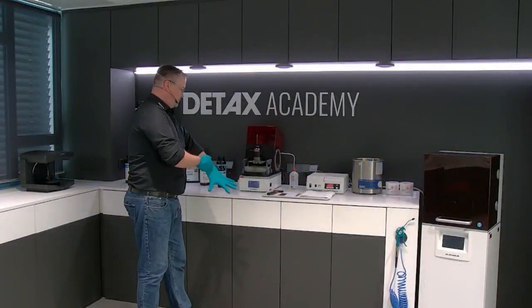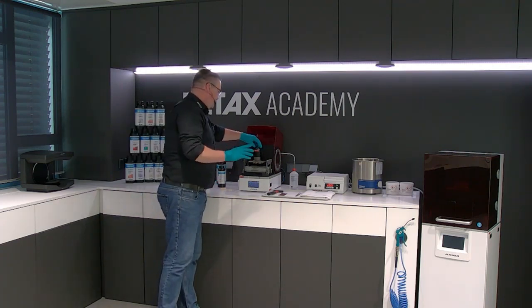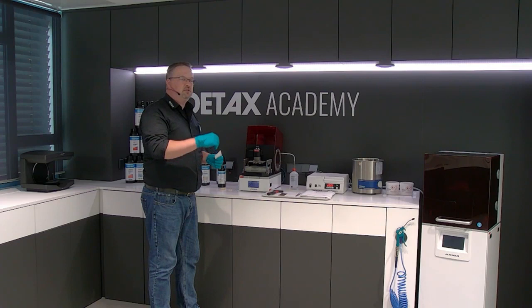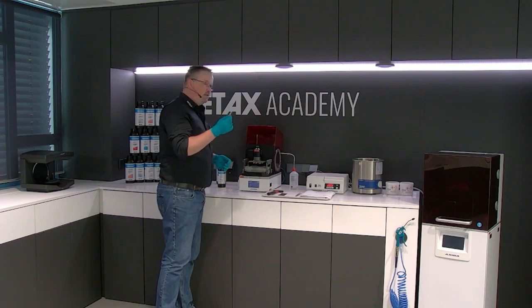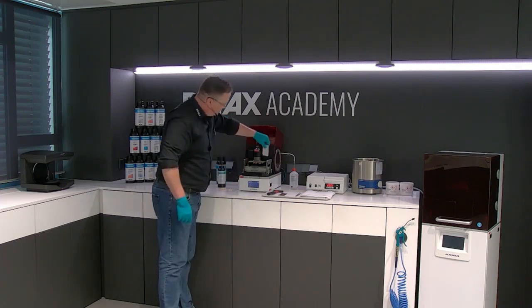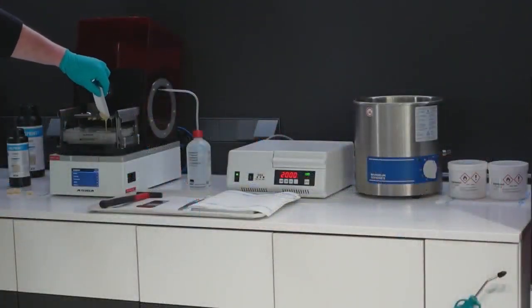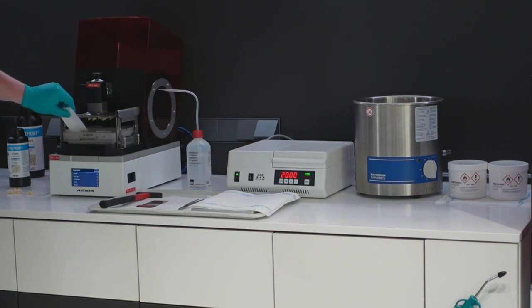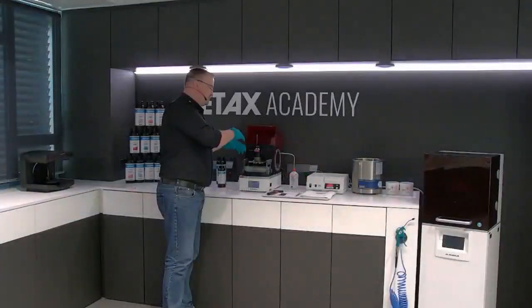Sorry for the noise. So we can take out, sorry, at first, we have here some paper cards. These paper cards, please never use it for the vat directly. It makes scratches on the surface of the vat. Only use it to take the rest of the material, I hope you can see it, to take the rest of the material from the top of the platform back to the vat. So it saves material for you, to make sure that most of the material comes back to the vat.